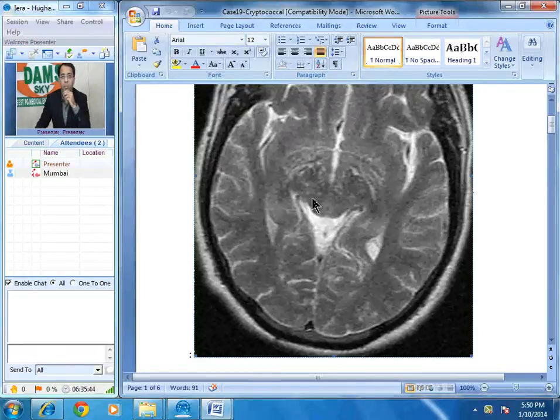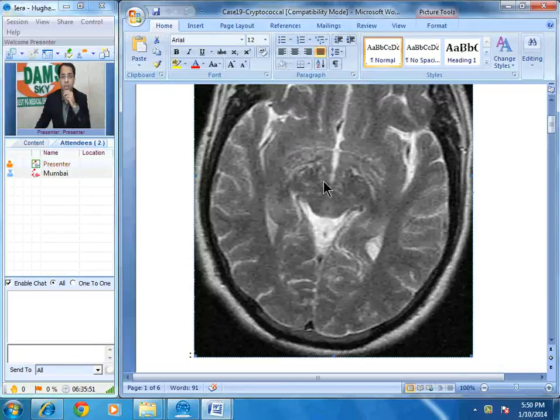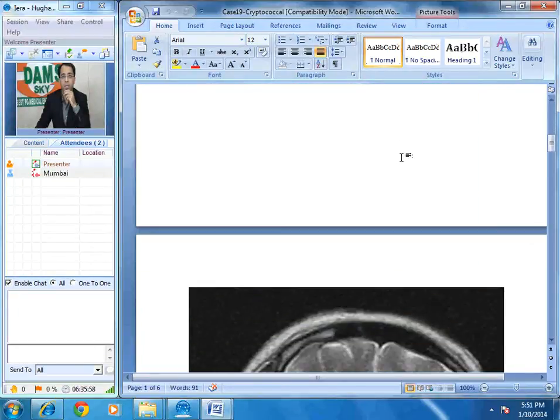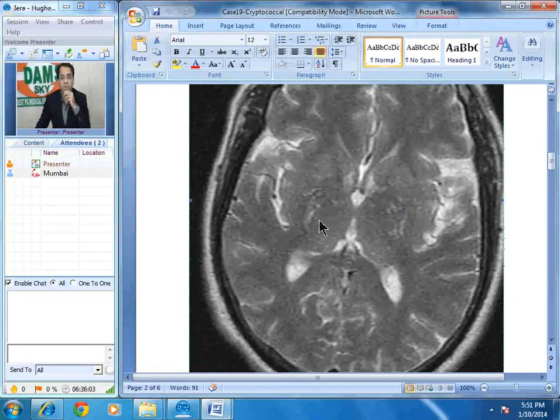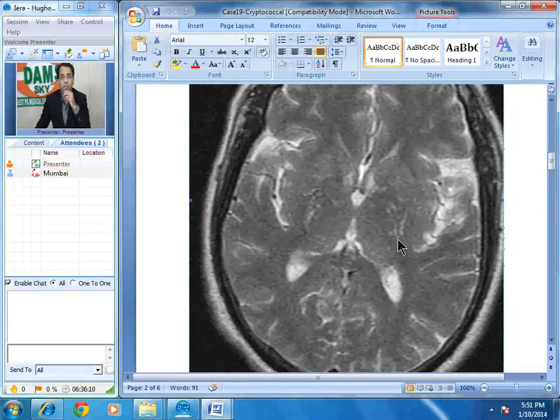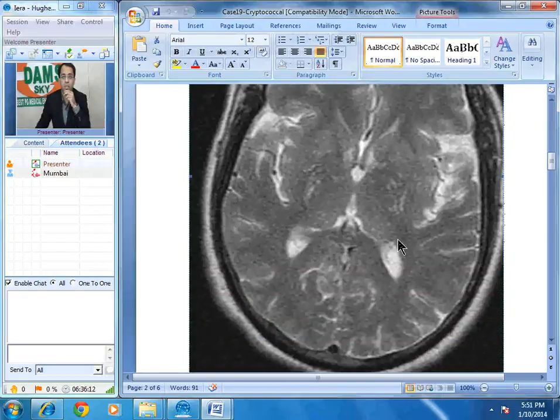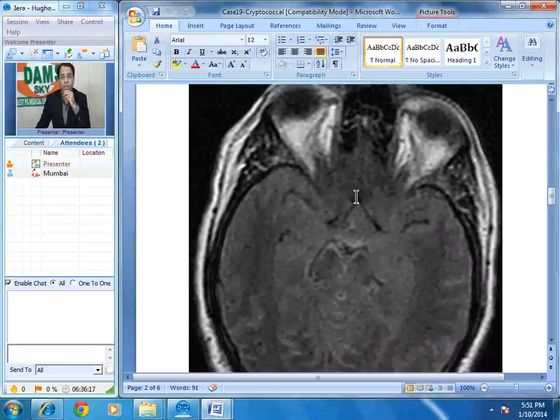On the T2-weighted image, are you able to see small 2–3 mm hyperintense areas in the area of the cerebral peduncle, extending into the gangliocapsular region? On another T2-weighted image, we can see small punctate T2 hyperintense areas in the gangliocapsular region bilaterally. Nothing else significant to appreciate on the scan.